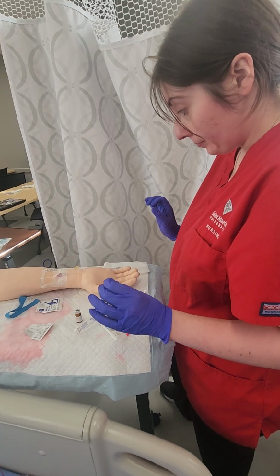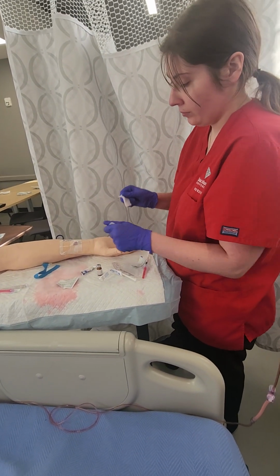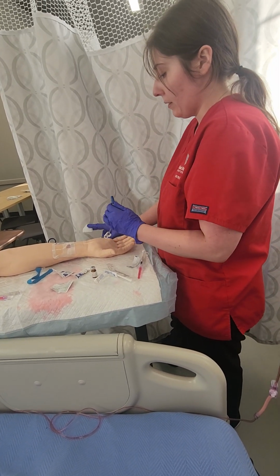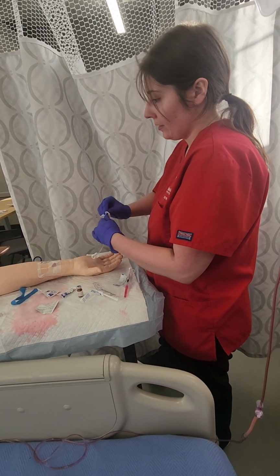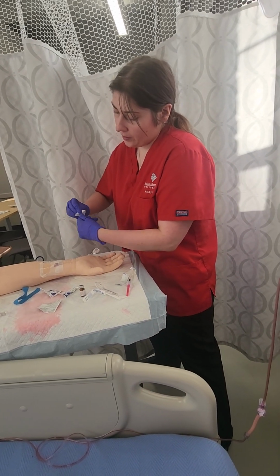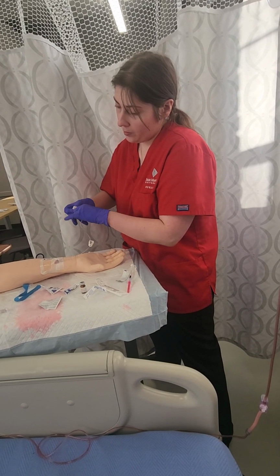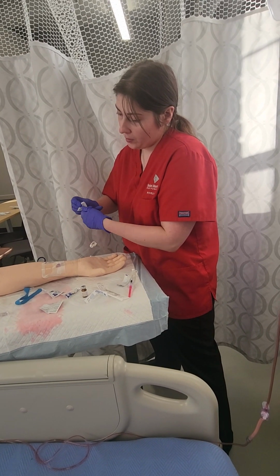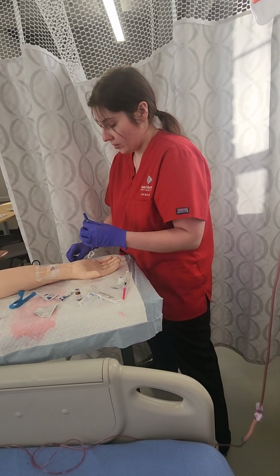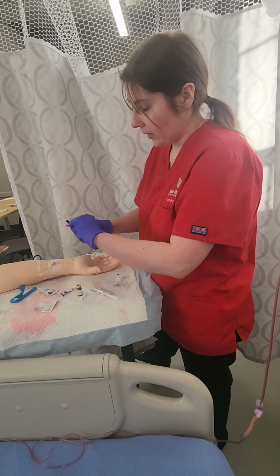Okay. And now I'm going to scrub the hub. Okay, and while I let that dry, I'm going to do my final check.